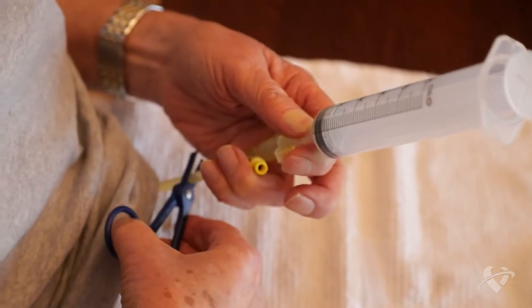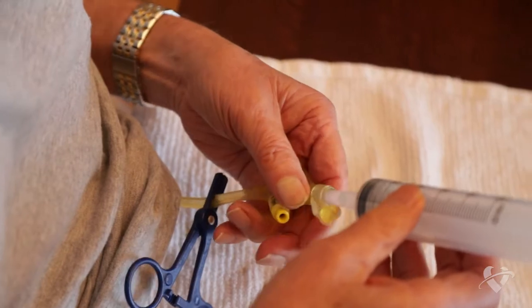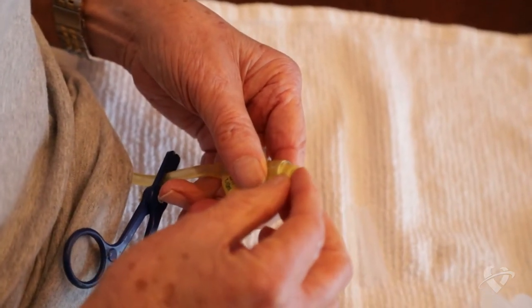Release the clamp or unpinch the g-tube before gently pressing the plunger to push the water through. Once again, clamp or pinch your g-tube before removing the syringe from the feeding port and replace the cap.